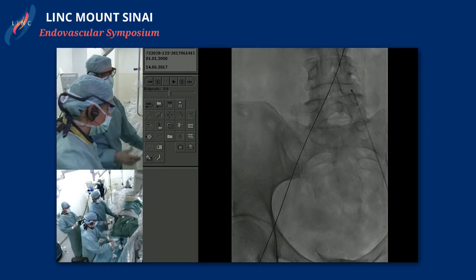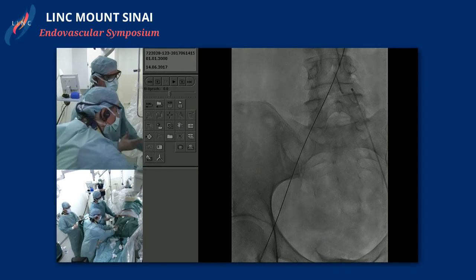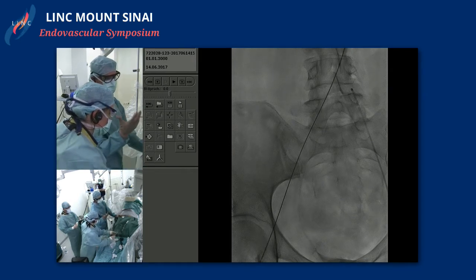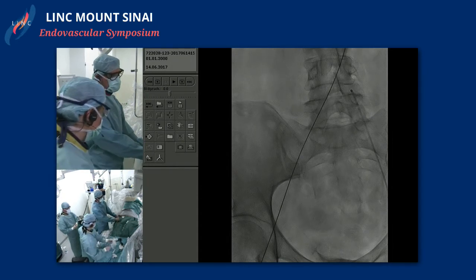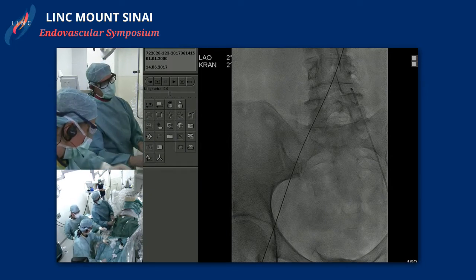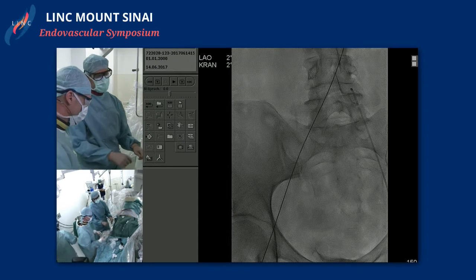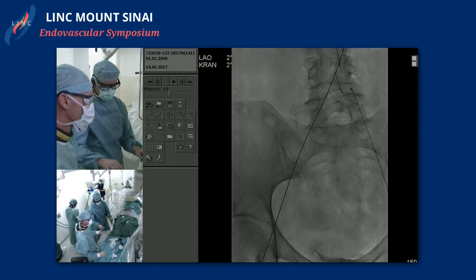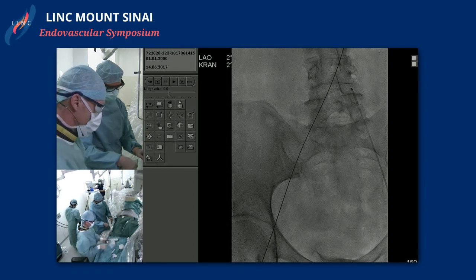So I think you need a stiff part at the Turner point, clearly. Then there comes another, so-called second Turner point, where the vein usually goes over the external iliac artery, where you should also have a relatively stiff part with a good radial force. And those two points are really addressed by the sinus oblique stent.